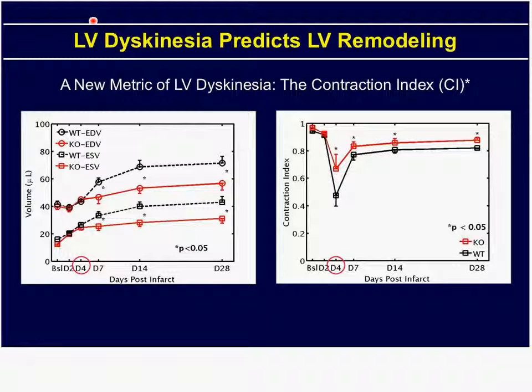We have found that heart rate does increase slightly after MI, but I would suspect that what we're really talking about here is having trouble picking up the ECG, because the heart rate is pretty regular. It is increased some. One can compensate for that by cooling the mouse down a little bit, but that, of course, impacts your cardiac function. Right. So we're religious about keeping our mice at 37 degrees and documenting that with the thermoprobe. Okay, that's a good tip.